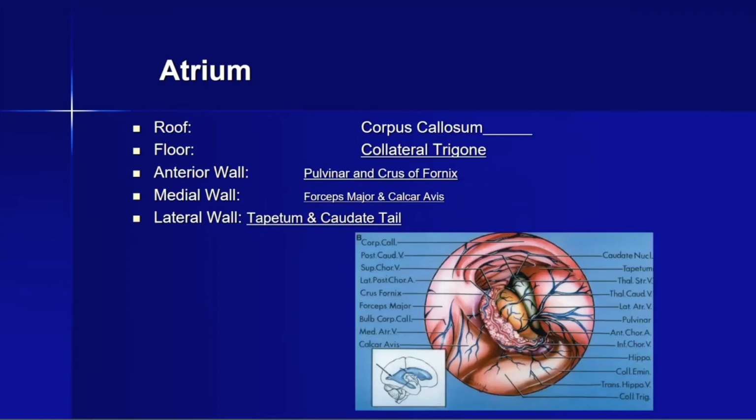So anyone and everyone who's put in enough number of posterior shunts will have horror stories about how these posterior shunts can potentially create havoc, right? So these anatomical landmarks are actually really helpful for the residents to know, to realize some of the potential havoc that can be caused by catheters that can go off target.